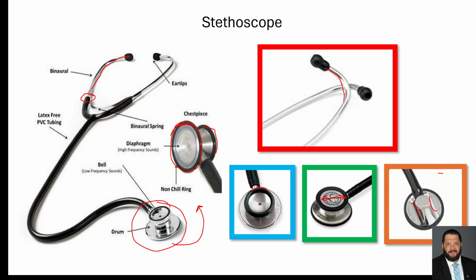A $30 or $40 stethoscope is really all you need. The problem with higher quality stethoscopes or more expensive stethoscopes is oftentimes you'll pick up a lot of ambient noise. The back of an ambulance is not a quiet environment, so you lose a lot of diagnostic capacity that you get with the higher end stethoscopes to the ambient background noise that you have in your work environment.